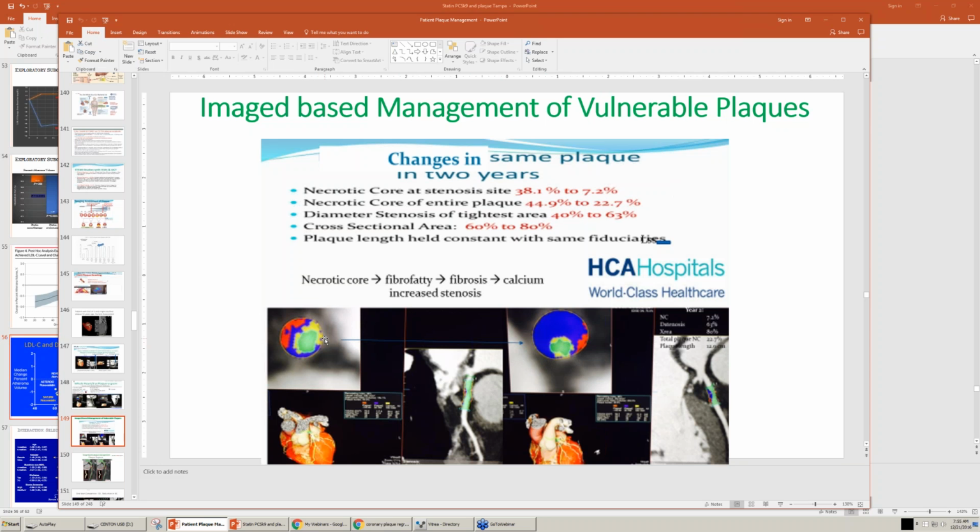This is actually a bleed over. It looks like a calcium halo around the lumen. Well, that would be very protective, and that would be a very nice thing to have, but that's not what's happening. This basically is a bleed over of the color green and the color blue, making the color yellow, and basically is an artifact produced by this particular software.